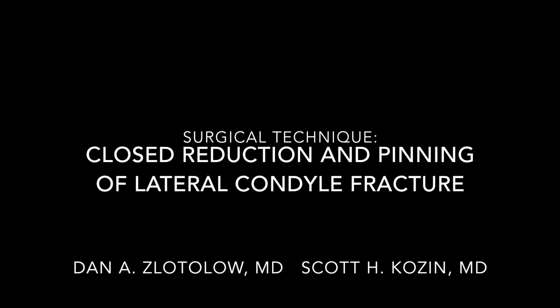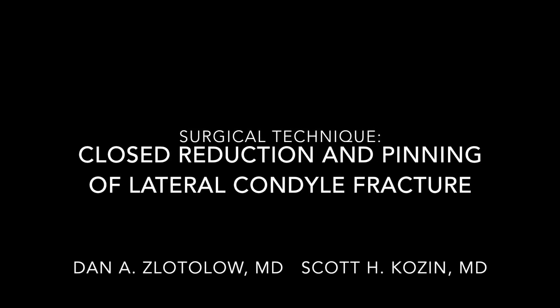This video will demonstrate a closed reduction and percutaneous pinning of a lateral condyle fracture in a 14-year-old boy with a 2-week-old injury.